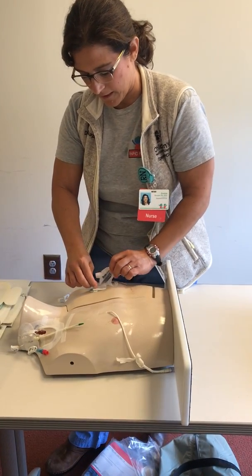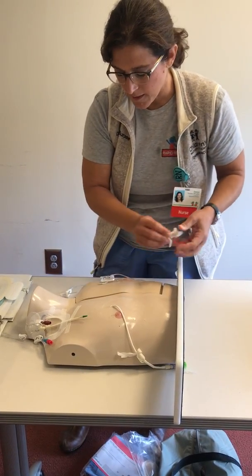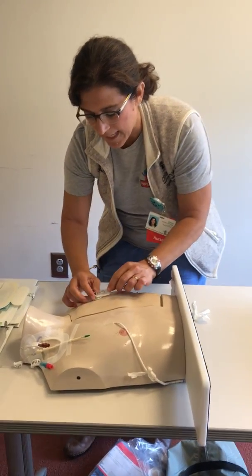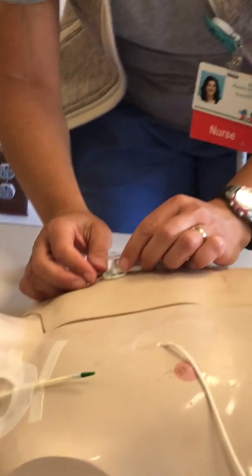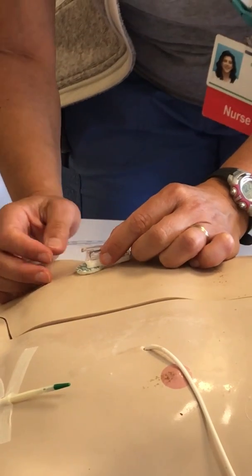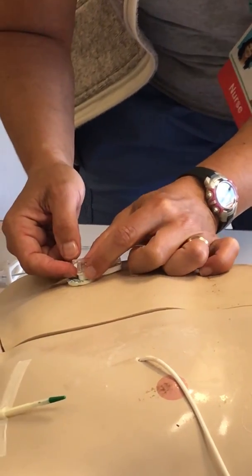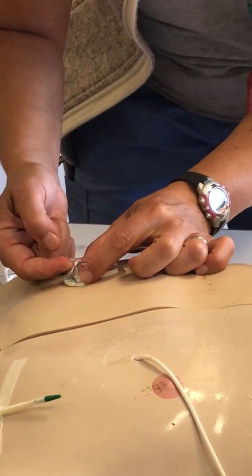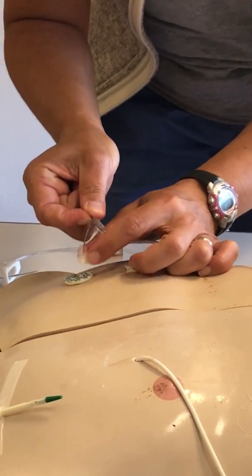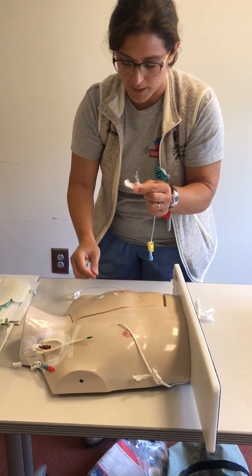The stuff is too sticky, so it's hard to use gloves on this guy. Anyways, if you haven't de-accessed a port before, simply pulling it out is painful for the kids. There is a little hook right here that makes it easier. If you just hold down the sides and pull up on this, it'll lock and the port will be taken out easily, and it's not as painful for the kids.